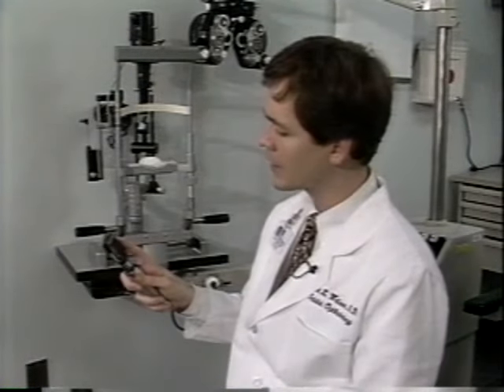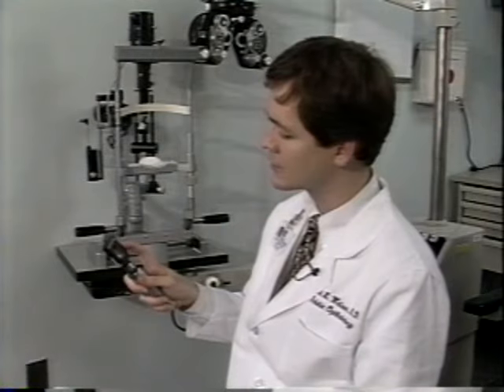Hold your ophthalmoscope like this so that you can adjust the focus during the examination. Your right hand and your right eye should be used to examine the patient's right eye, and your left hand and left eye to examine the patient's left eye. Failure to do this can put you nose to nose with your patient and result in a very awkward situation.